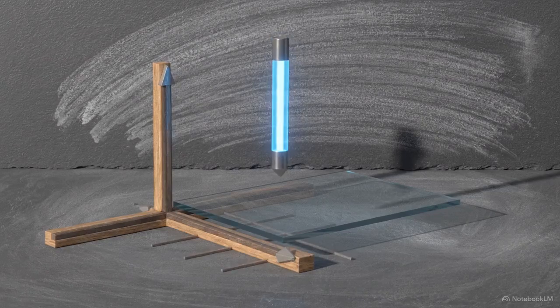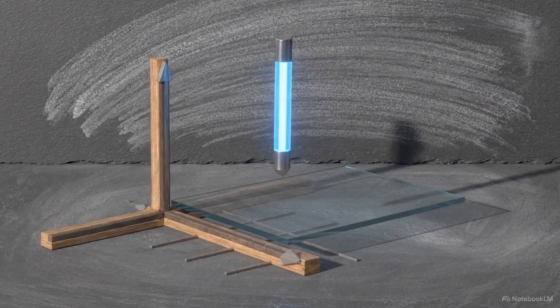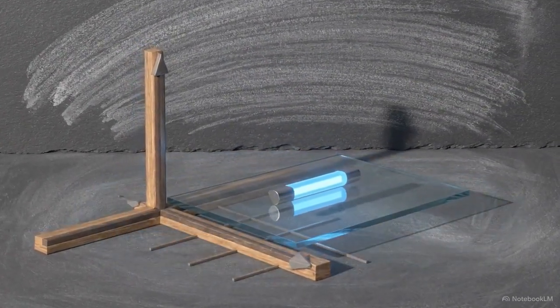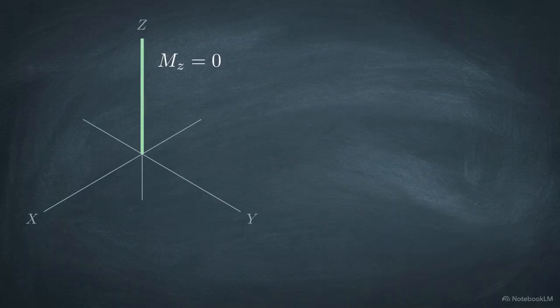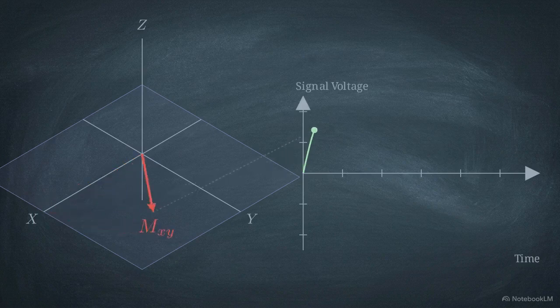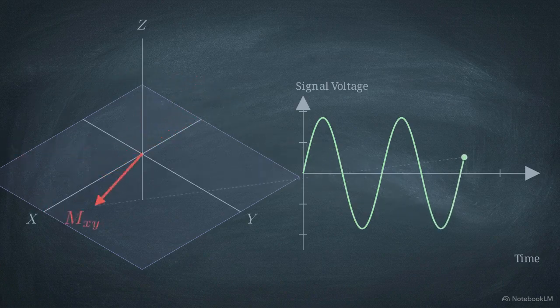Right after the 90-degree RF pulse switches off, an MRI sequence begins. The targeted proton's magnetic vectors snap down onto a flat horizontal plane. Here, longitudinal magnetization on the vertical z-axis is entirely empty, registering at absolute zero. Simultaneously, on the xy plane, transverse magnetization reaches its physical maximum. These precessing nuclei rotate in phase, generating a sinusoidal electrical voltage measured by the scanner.